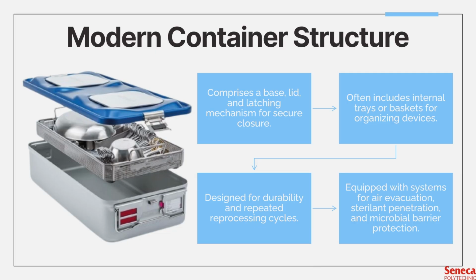Some designs include label holders for data cards and identification tags to help track set name and sterilization details. But these data cards that go inside these little nooks are more of a permanent solution, which hospitals do not like to use. Say the data card says this container is specifically for orthopedic instruments.